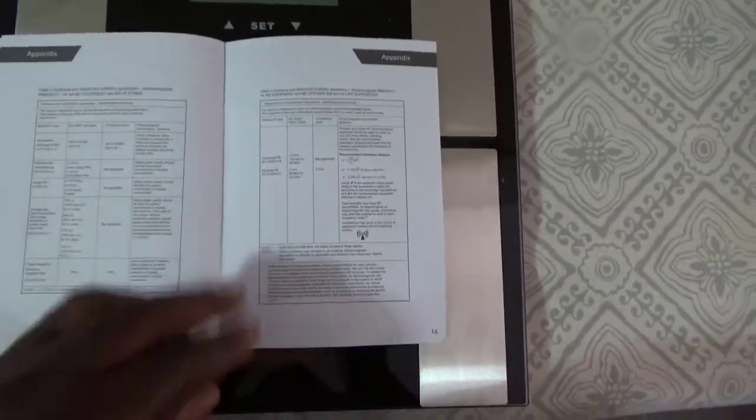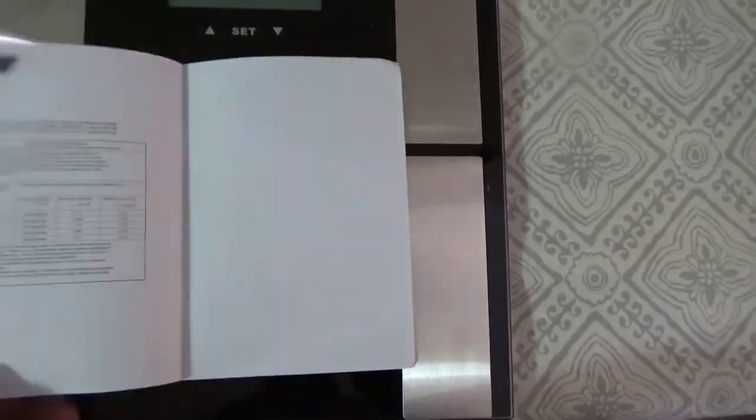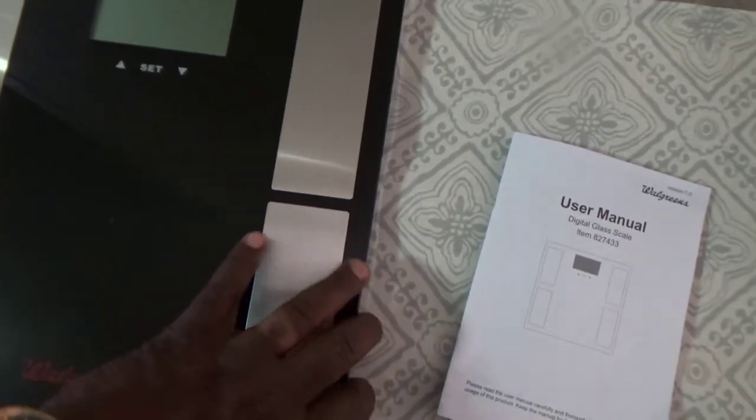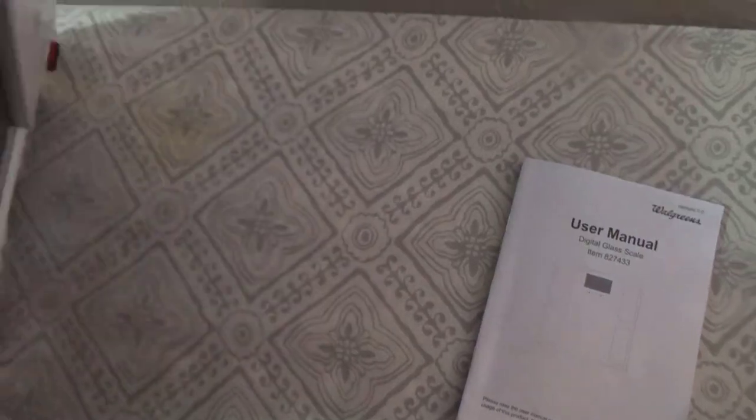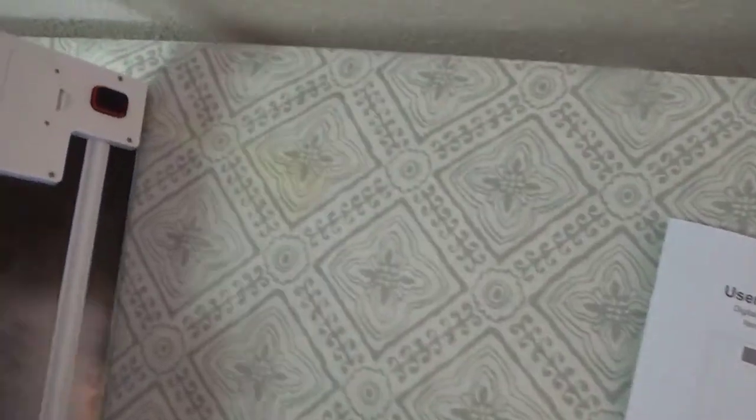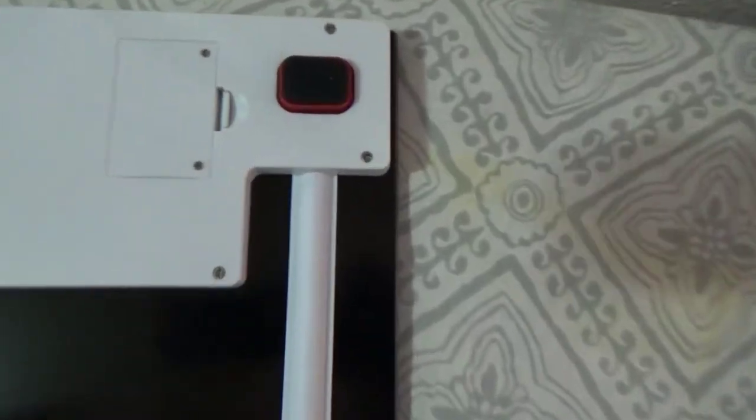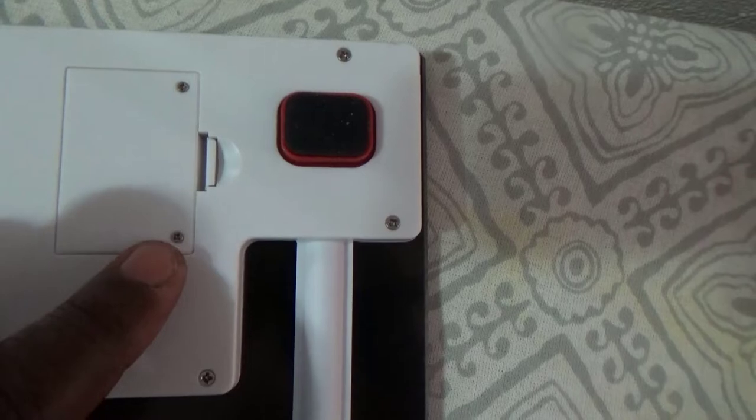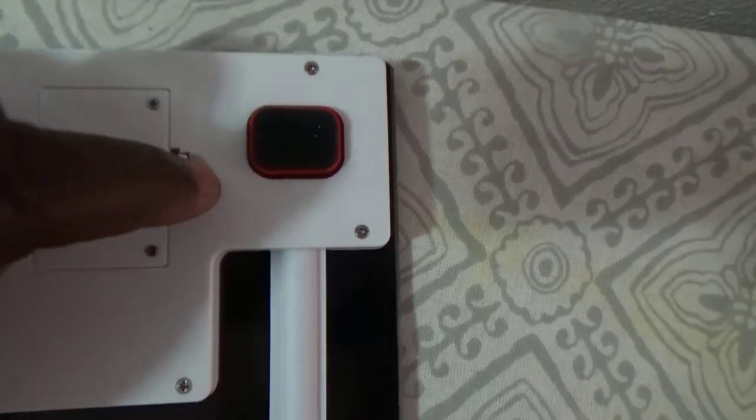First of all, once you look through the manual, you want to turn it over on the back. It uses 2032 batteries, like watch batteries. Just take these two screws out, but this already comes with batteries installed. It has a little plastic tab, you just pull it out.